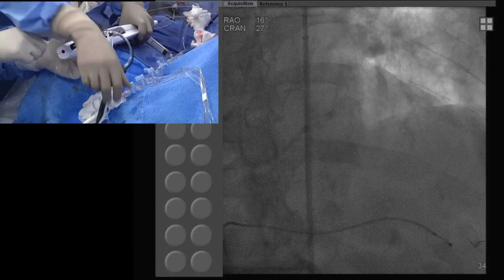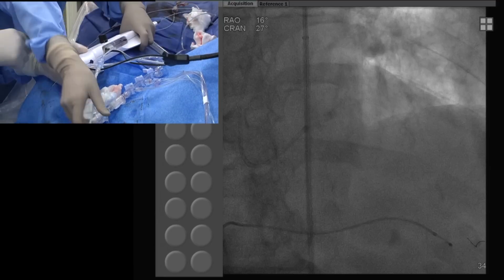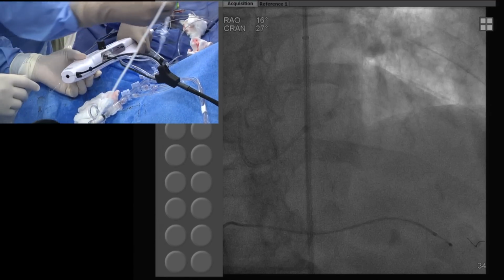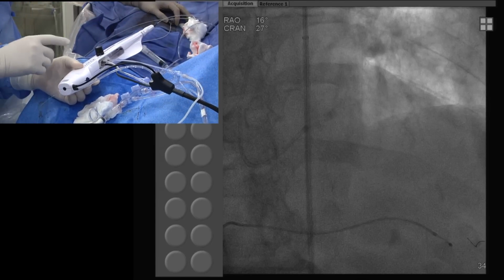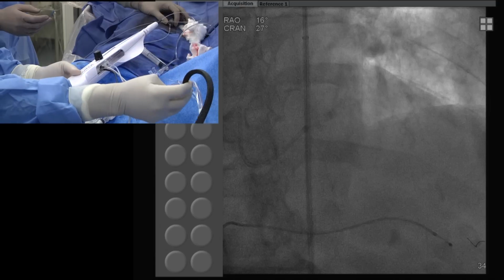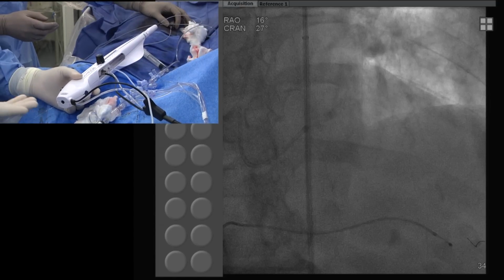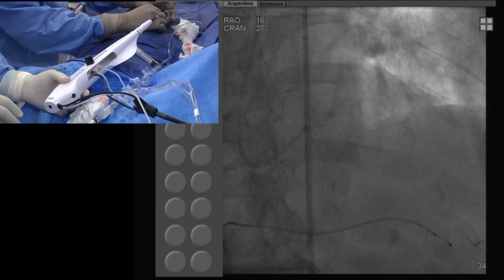One issue is there are multiple buttons. All those will change in the next few months. That one button on the top will become both Dynaglide as well as the main speed. Things will change, but most important is this, which we call the Python. The Python will become simpler very soon, within a few months, because that's one of the big disadvantages which people have mentioned about it.